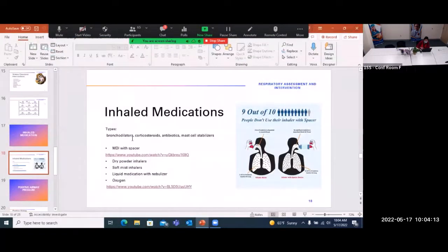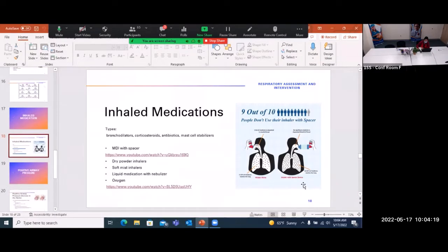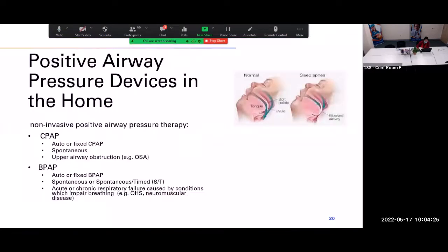Okay, so that was the last of the videos. And I'm just going to tell you a little bit about some other treatments you might see at home for your clients. So positive airway pressure, this could be CPAP, it could be BiPAP at home. Some of your clients with obstructive sleep apnea might have a CPAP machine at home.